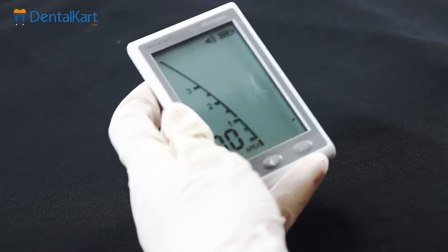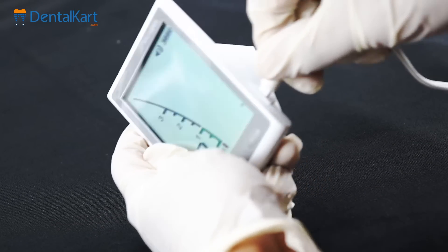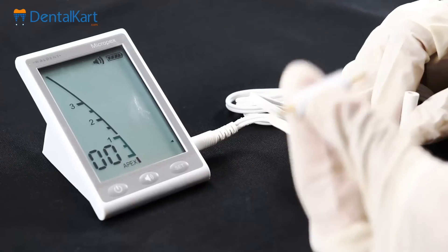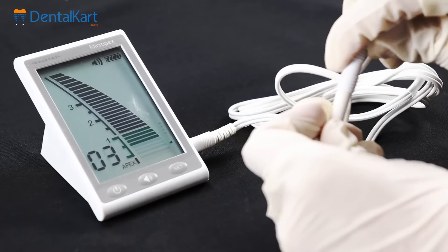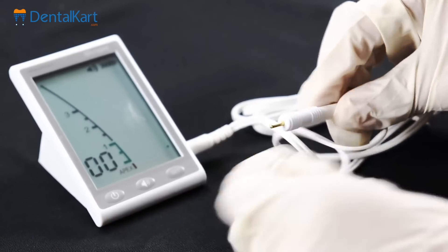First, turn on the device. Plug the measuring wire into the corresponding slot. Attach the tester to the measuring wire from both ends, and the reading should be between 0.2 to 0.4. Then unplug the tester.